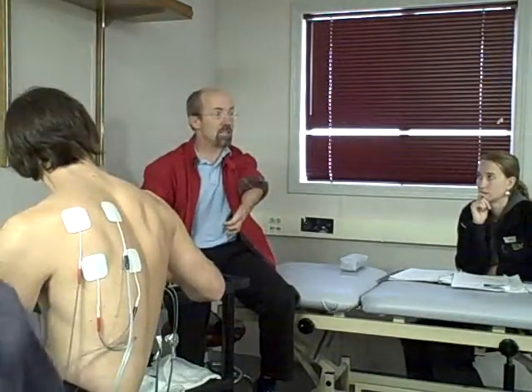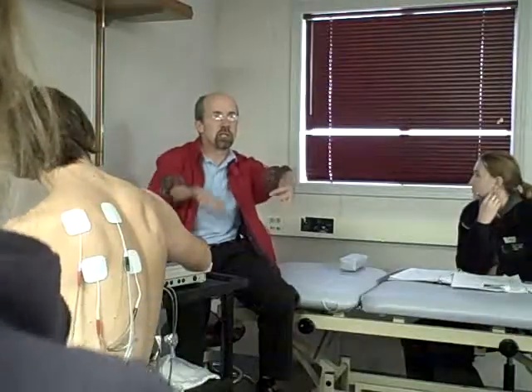And then how do you get them both? By default, when you're setting the intensity, both go up together. But this particular box has the ability to allow you to change it slightly between the channels if that's really what you want.